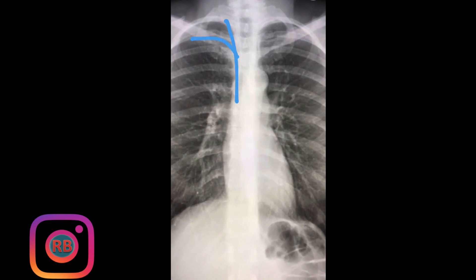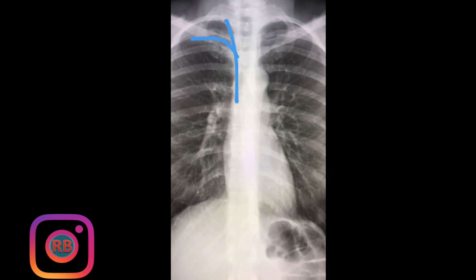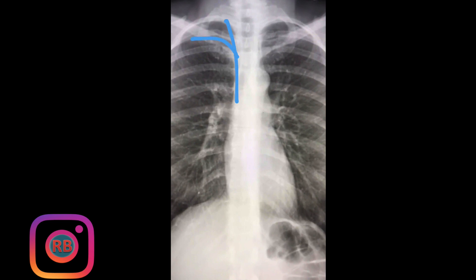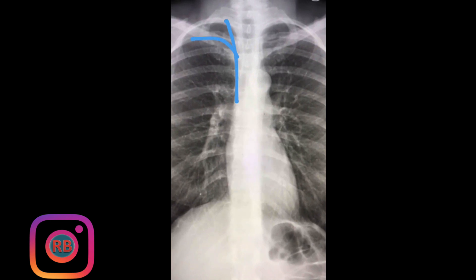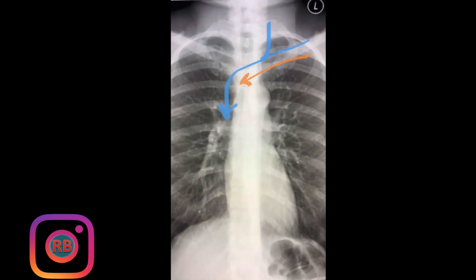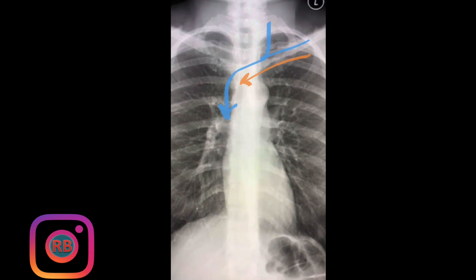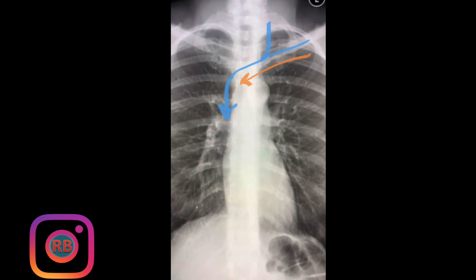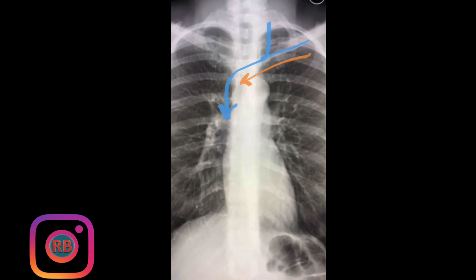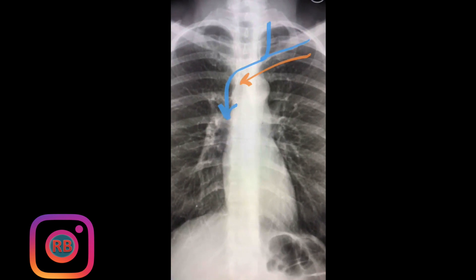This means that if you're inserting a venous line via the right side — whether it's the right internal jugular or subclavian veins — it should remain on the right side of the mediastinum. However, if you insert a line via the left subclavian or left internal jugular veins, this line should always cross the midline from left to right through the mediastinum to reach the right side.